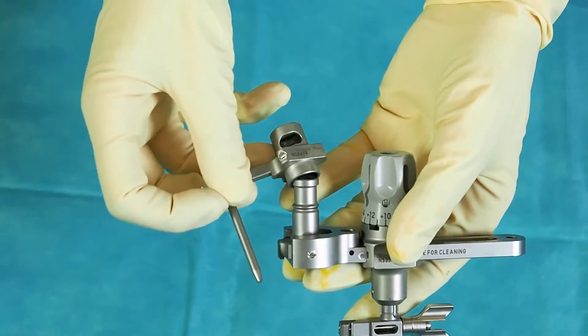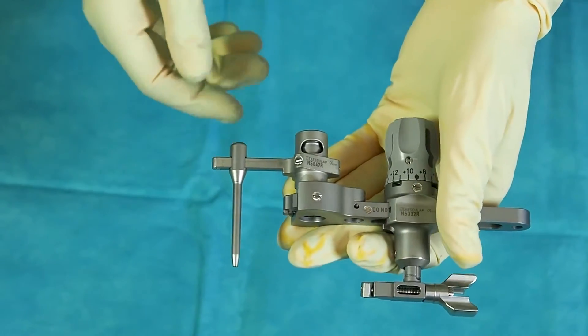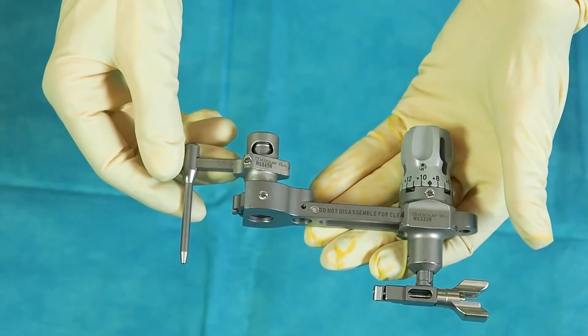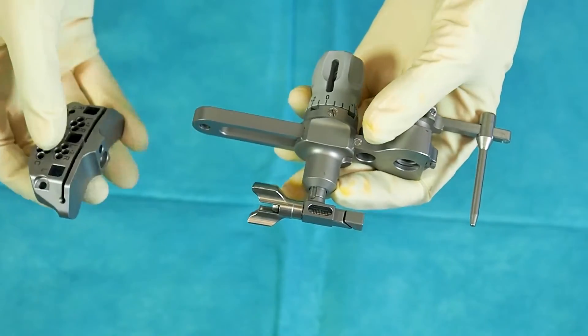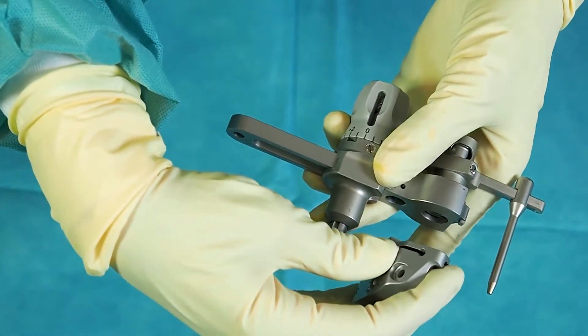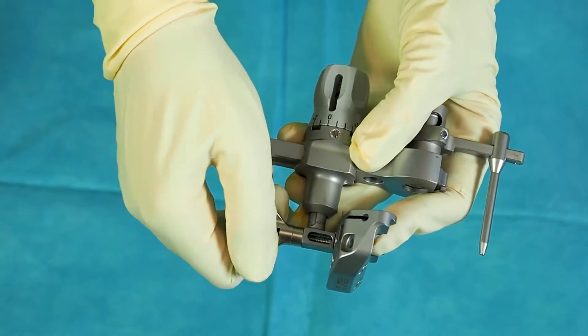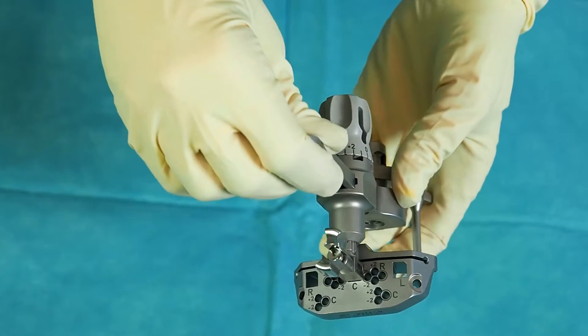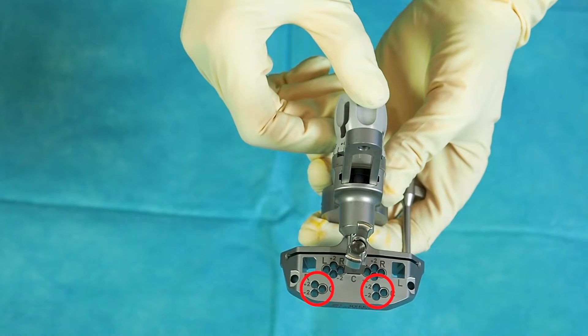For referencing the tibia cut height, attach the tibia stylus to the orientation sleeve by clicking in. Engage the assembly in the central connection square of the tibia cutting guide. For fixation, use the highlighted pinholes.